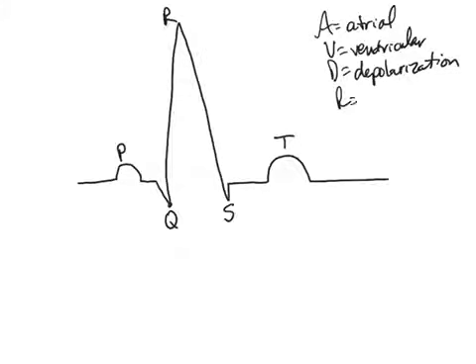And R equals repolarization. So if we were to ask you, where is this point? If I would draw and I'd say, hey, what's this point? Make sure you answer just Q. If you answer QRS complex, I'm going to mark it wrong because this location is only Q. So don't be lazy. Make sure you know the exact position of that.